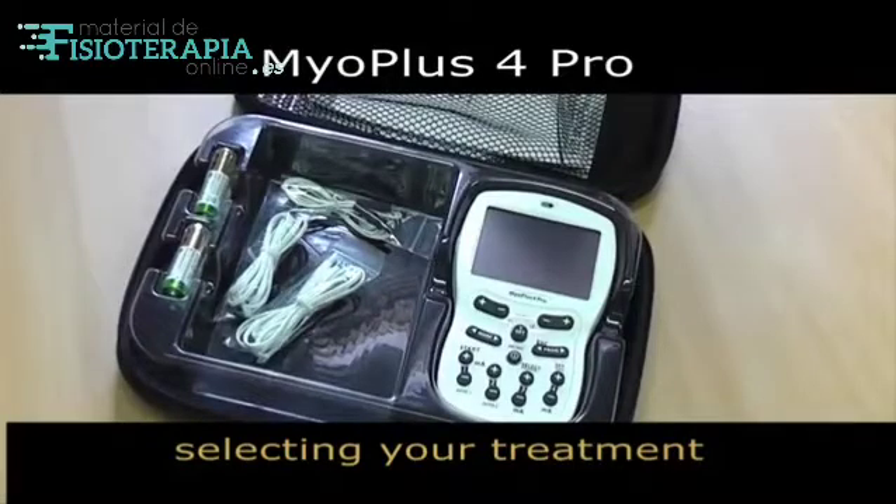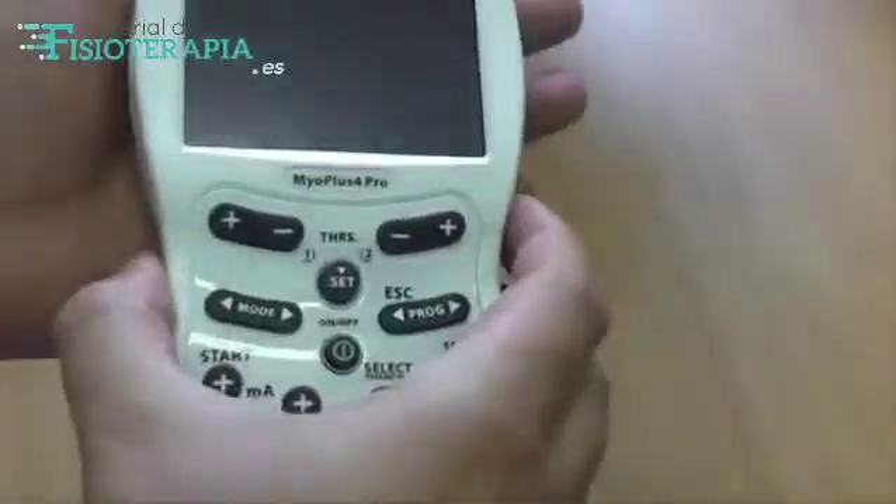In this video we will show you where to start and how to select your treatment program. This EMG Triggered Stimulation Unit, or ETS unit, either measures muscular activity or stimulates the muscles.